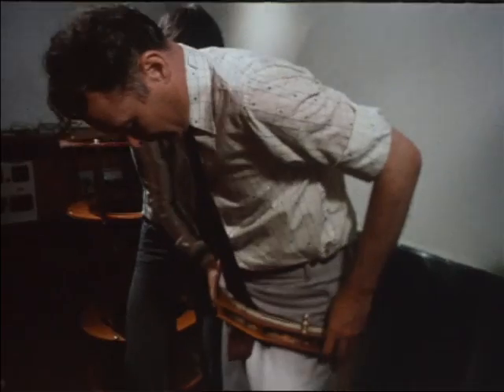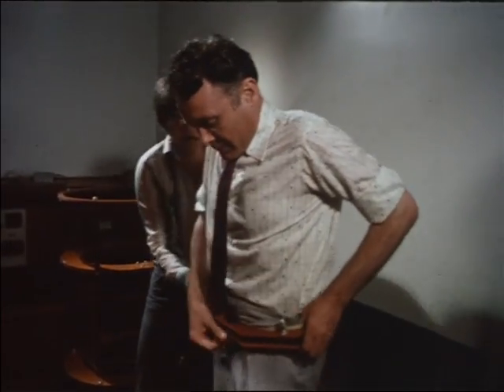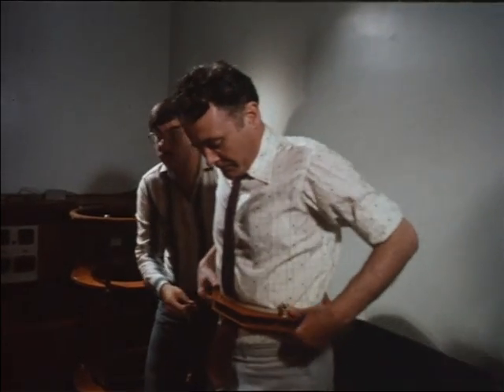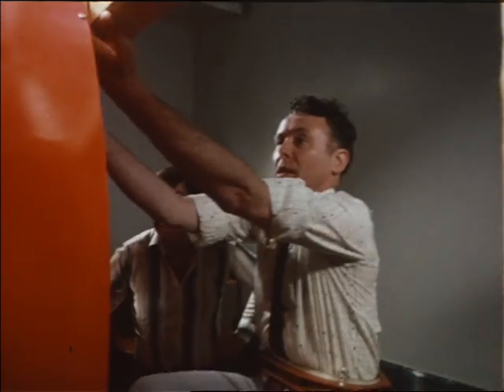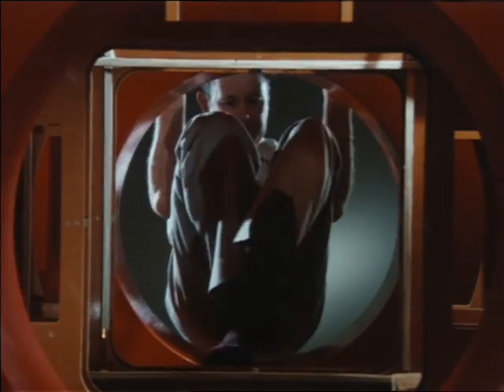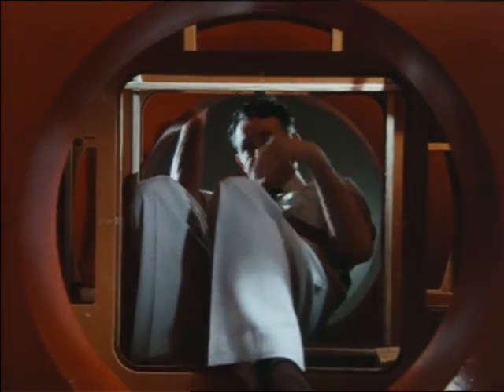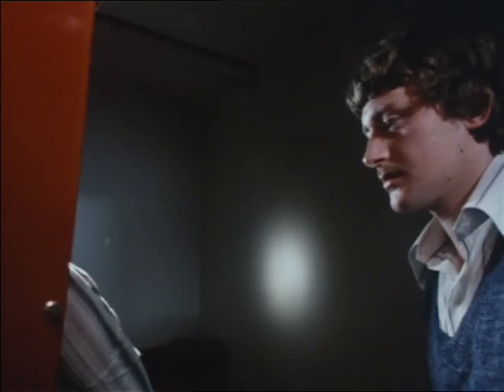Dr. Mansfield, the leader of a second group in the same department, in the best traditions of medical science, is experimenting on himself. First, he puts on the receiver coil, the coil that picks up the signals returning from the body, the ringing of the hydrogen nuclei. He then climbs into a specially constructed giant magnet. It must be pointed out that this is the development model, and any production models in the future would pay more attention to patient comfort.